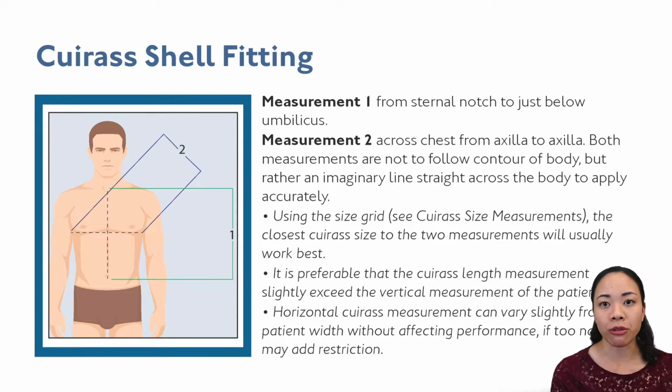Measurements from their torso lengthwise should be from sternal notch to just below the umbilicus, and the measurements widthwise should be from mid-axillary to mid-axillary.